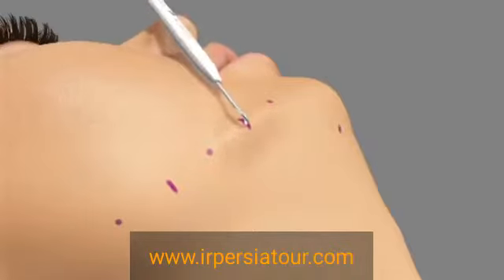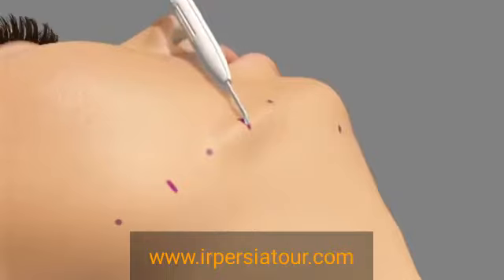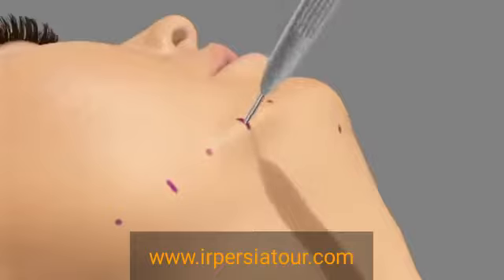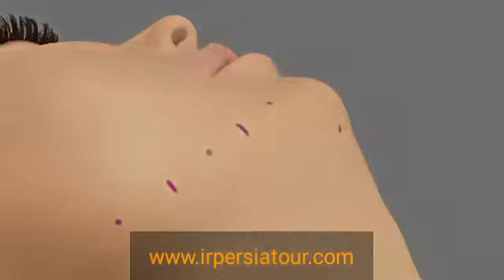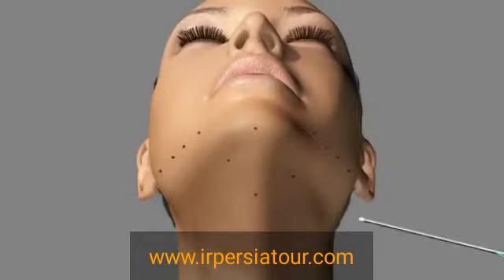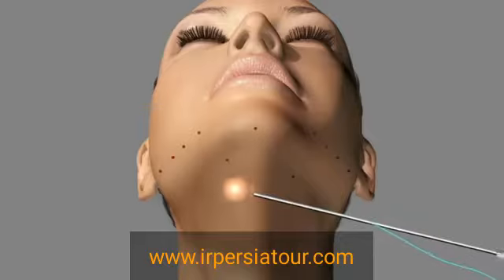As the clearing device is inserted, it is then rotated upwards so that it is perpendicular to the skin surface and is elevated. Some blanching can be seen where the tip of it is located as it is rotated clockwise 2 to 3 times. The matrix is then created by grasping one of the suture rods which exited through the puncture wound where the neck defining suture was placed. The midline, most posterior neck defining suture puncture site is used as the insertion site for the suture rod.